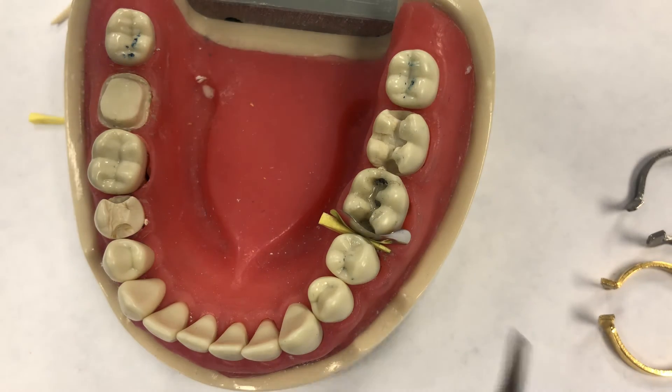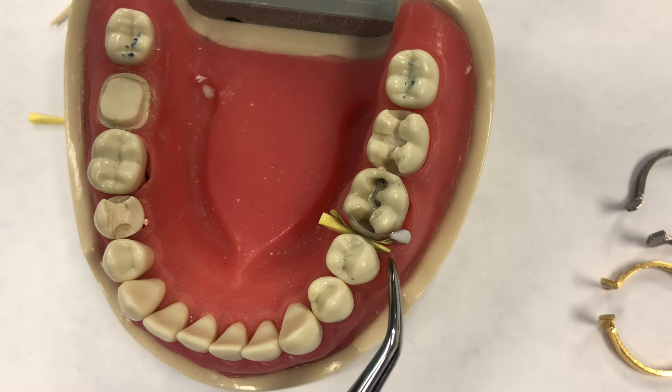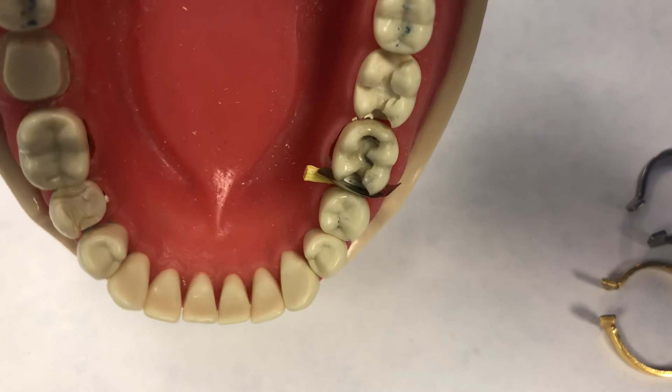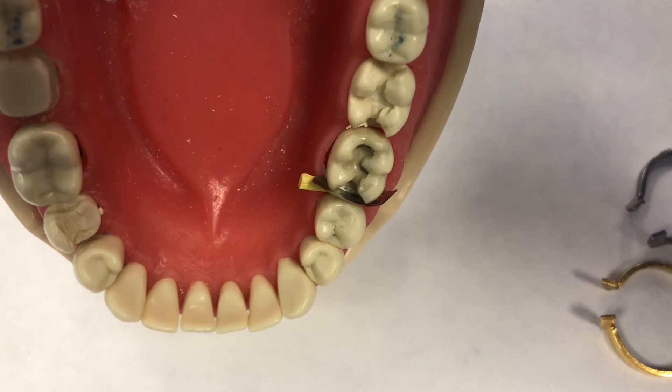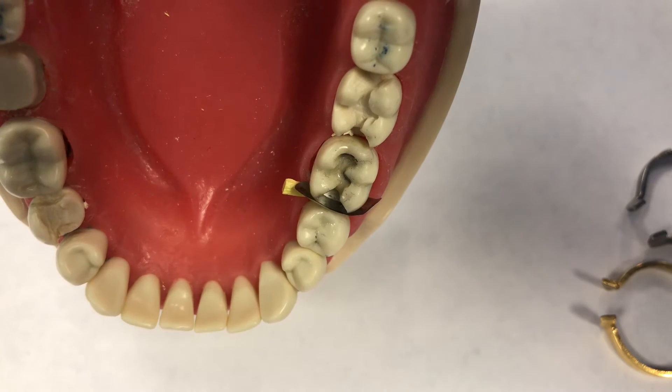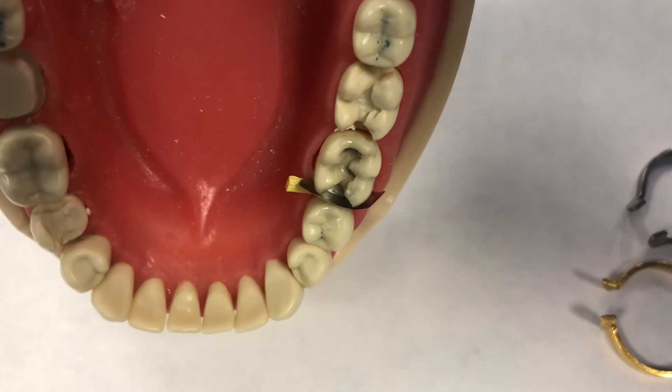You'll see the wedge come out on the buccal side. When you look down into the preparation, you'll see that the matrix is snug against the preparation.